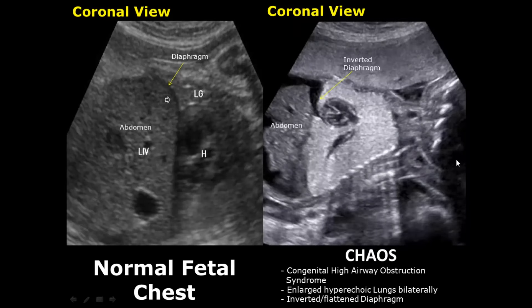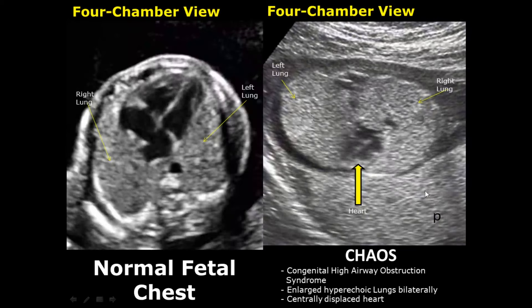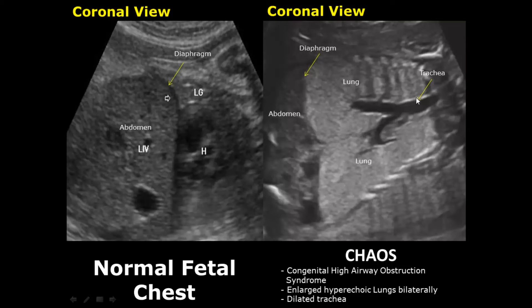CHAOS stands for congenital high airway obstruction syndrome. Both lungs will be enlarged and hyperechoic, causing inversion or flattening of the diaphragm. Here you can see the diaphragm is inverted because the lungs are enlarged. In the four-chamber view, the lungs are enlarged bilaterally and have displaced the heart towards the center of the thorax. In CHAOS, the trachea can also be dilated — here we can see hyperechoic lungs along with a dilated, fluid-filled anechoic trachea.